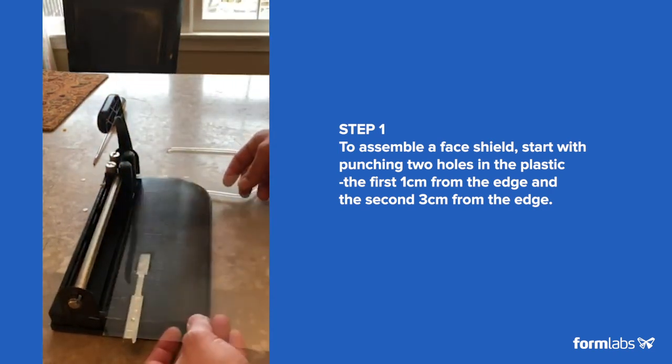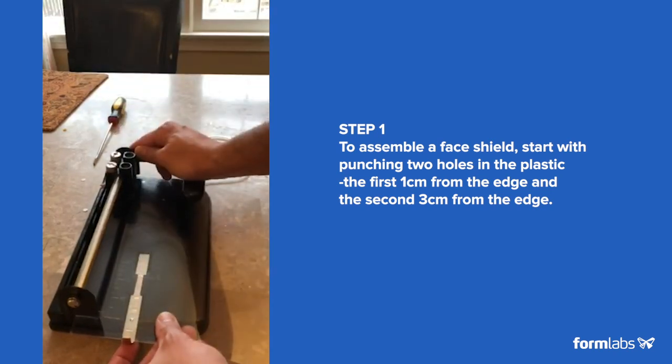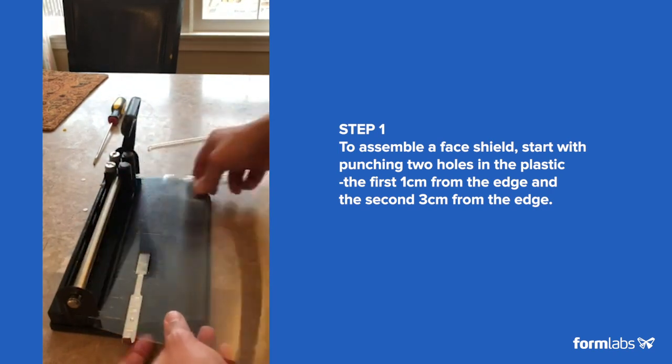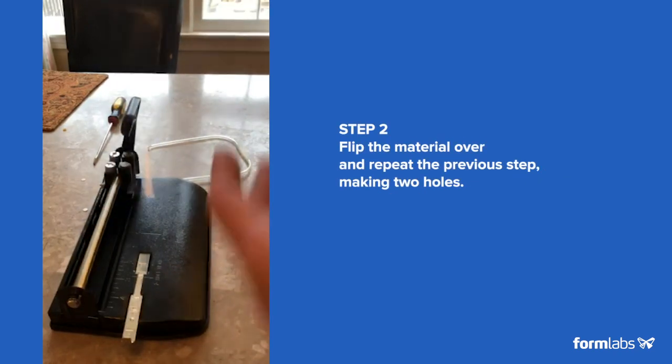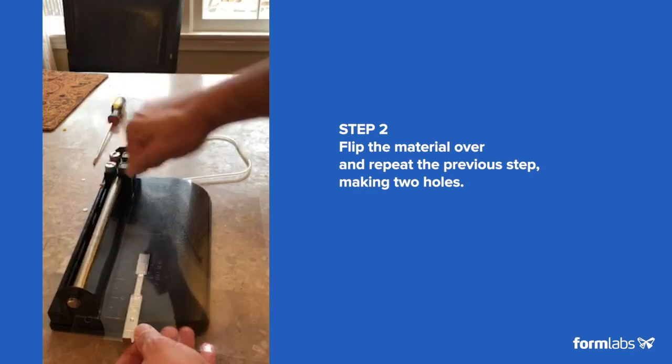I just make a punch hole like this, and then with the two puncher grouped on the corners. And then here's the holes — just flip and put the same thing, punch again.